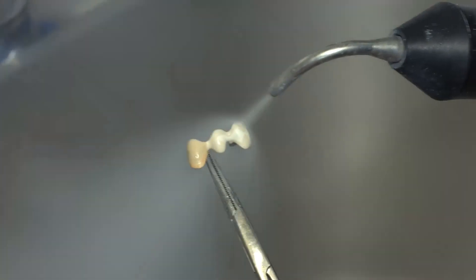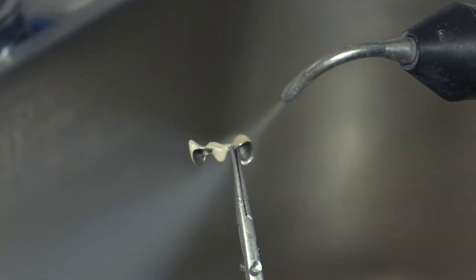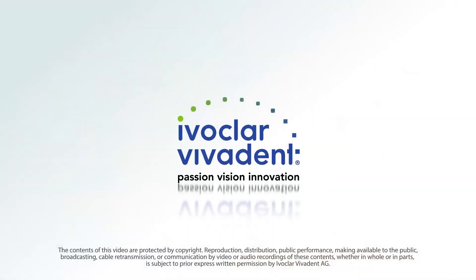Thoroughly clean the opaquer-covered metal framework using the steam jet. Once the framework is clean, you may start with the application of the ceramic.